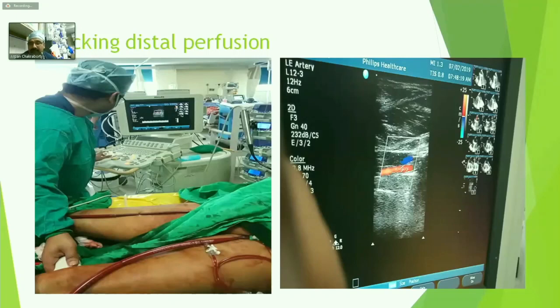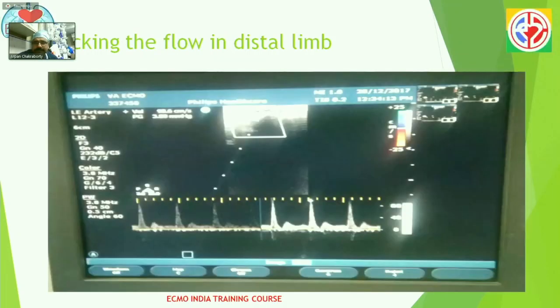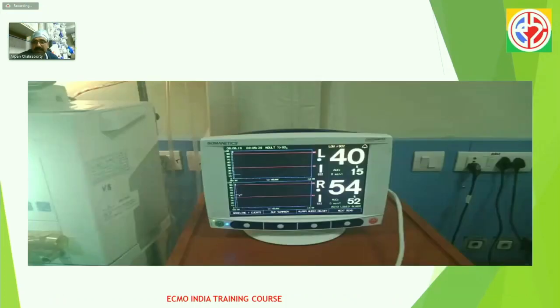It is not a pulsatile flow, but you should measure the mean pressure at that point of time, and it stops when you close the flow, and it reopens when you open the three-way. And this is the way we check the flow. Sometimes you get pulses; peri-arterial flow gives you some amount of pulsatility, or the balloon.